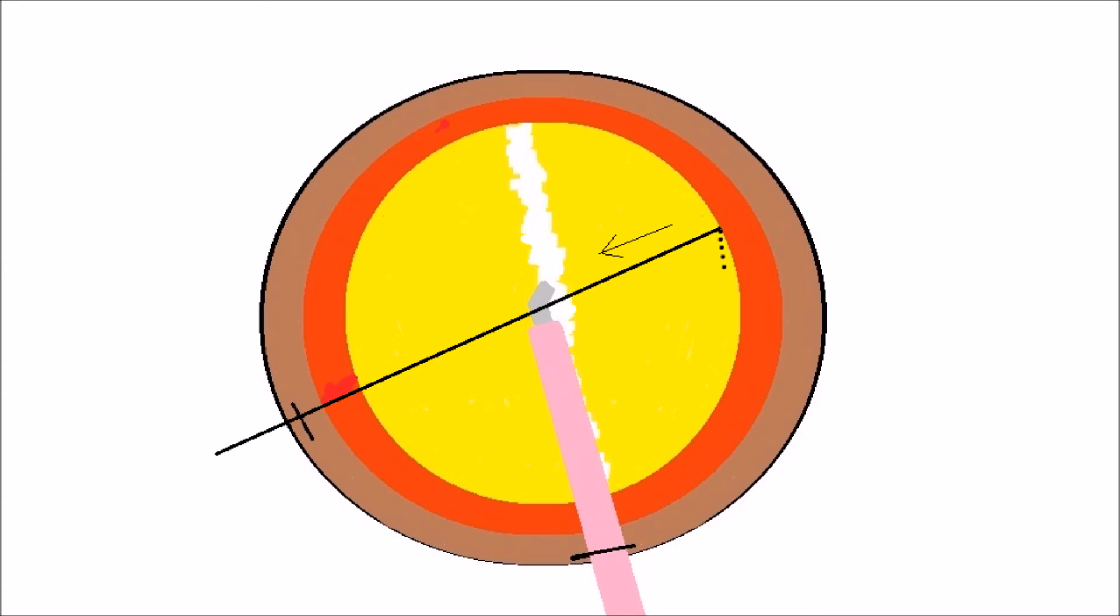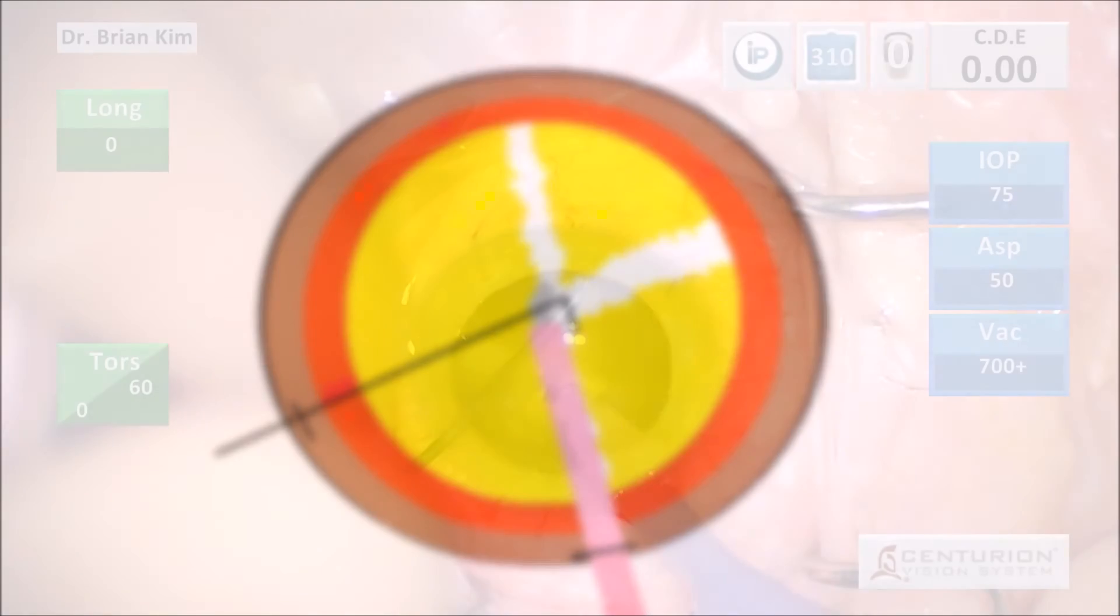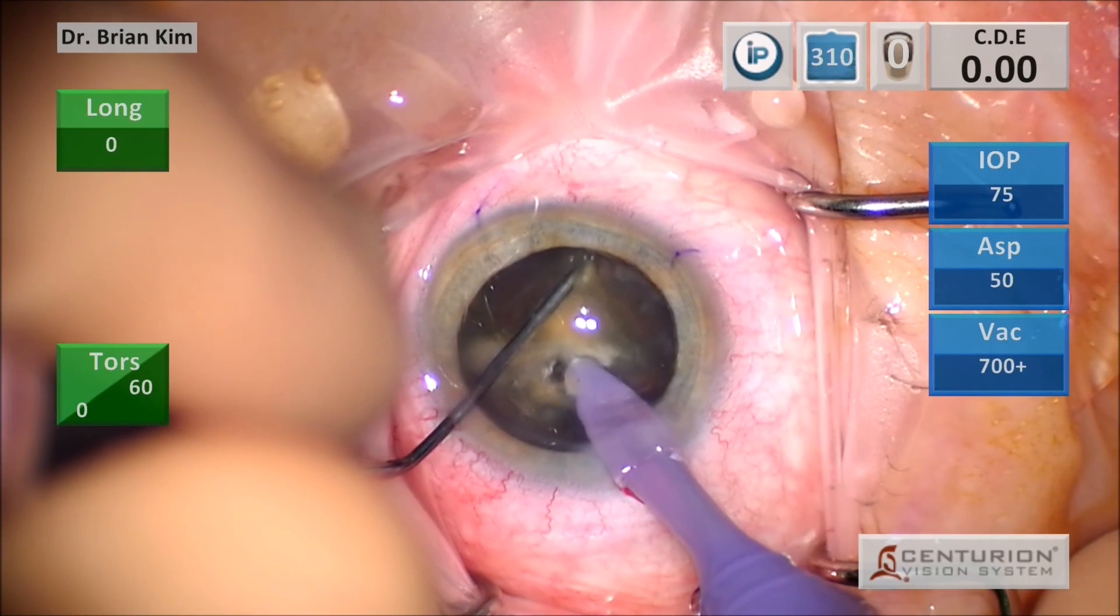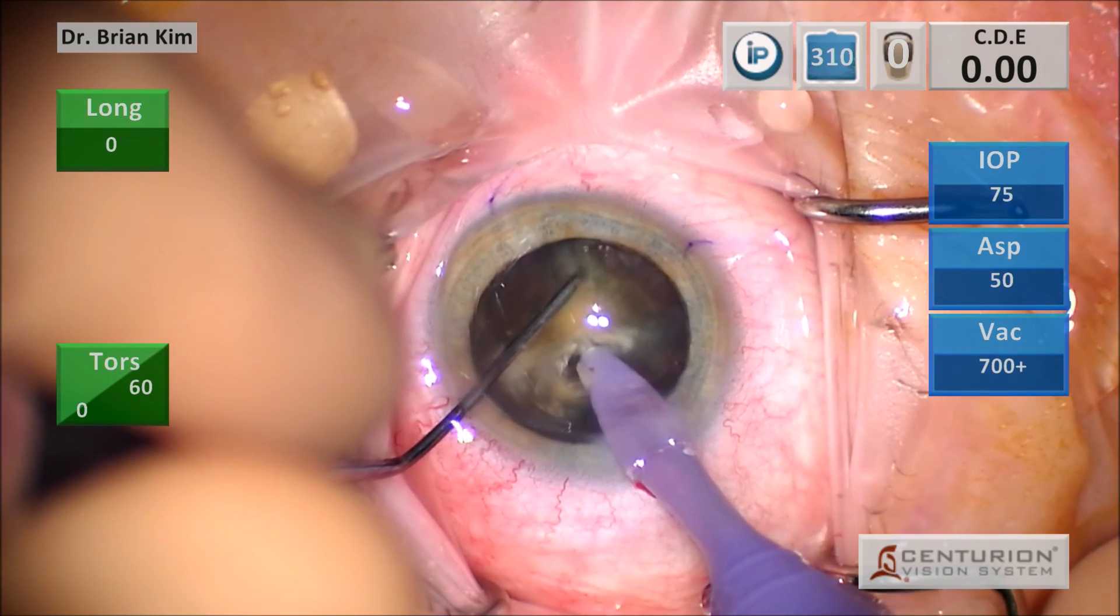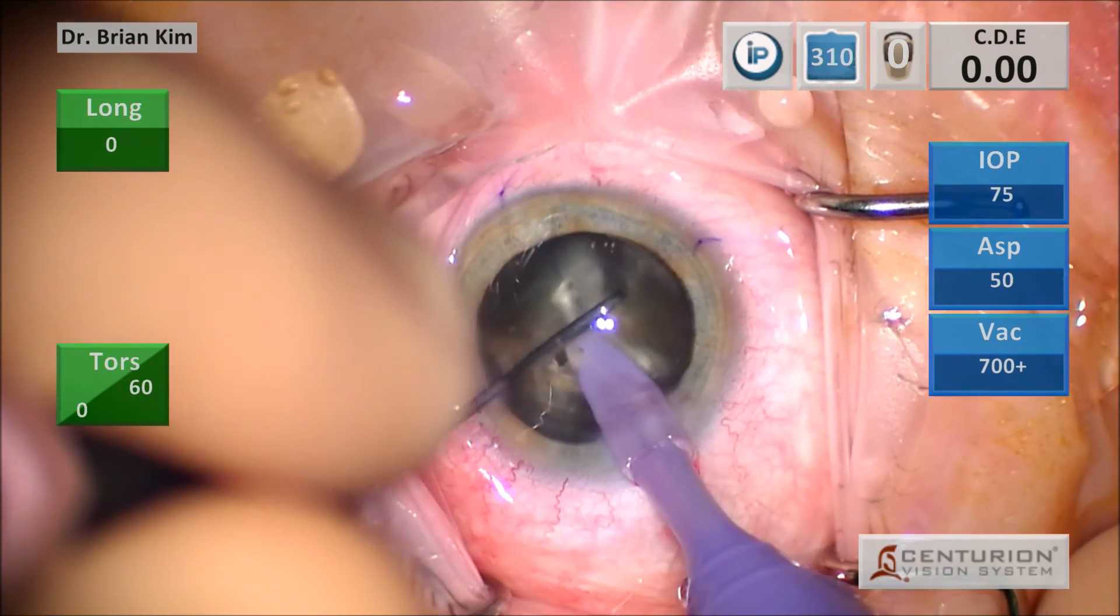This is a cross chop maneuver, where I placed a chopper out to the contralateral equator, bring it to the center to fracture that lens. That phaco tip is supporting the lens so that it doesn't move as I'm applying the forces to chop the lens by bringing the chopper centrally.